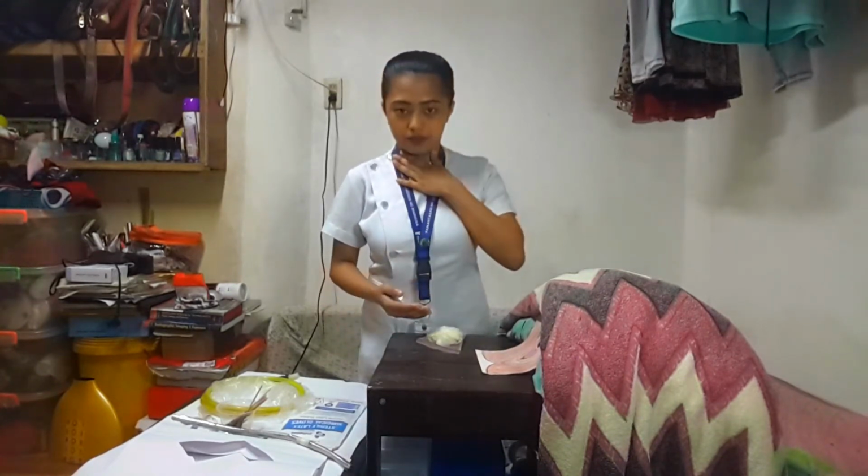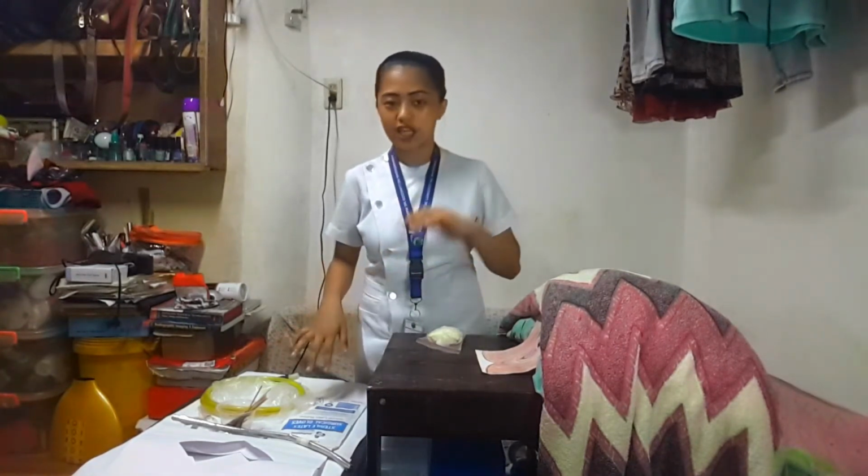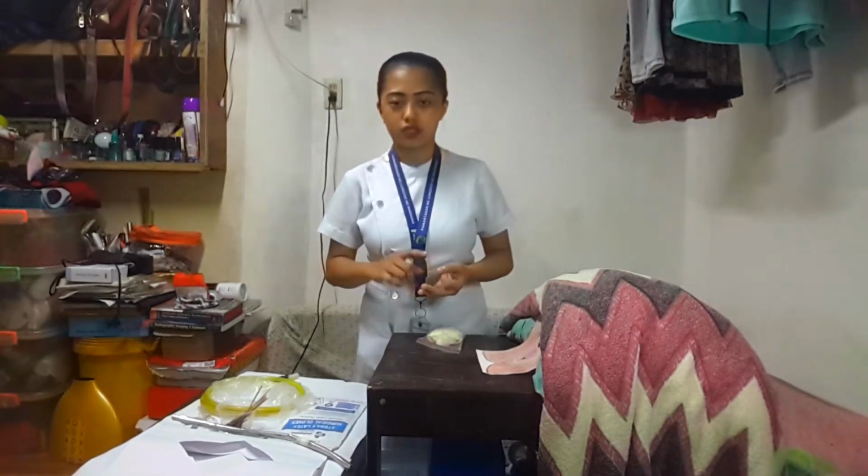Then the indication for the indwelling catheter, just like what I have mentioned a while ago, the indwelling catheter is what we will be using right now. So the indications are: first, monitor urine output; second, the relief of urine retention; third, the immobilized or incontinent patient; and lastly, the intraoperative patient.